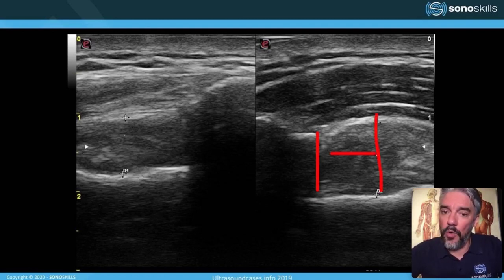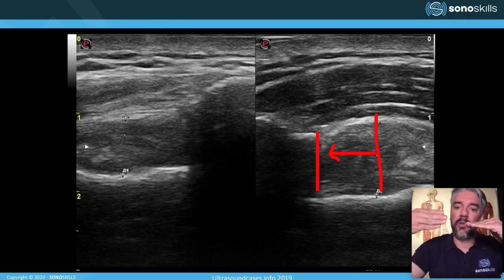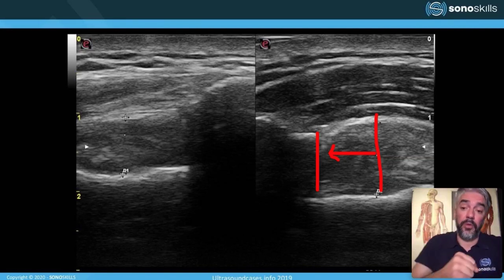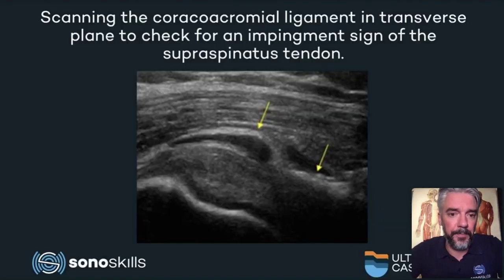So this won't fit into this inlet, the subacromial space, and friction is bound to happen. So you can see the tendon really hitting the acromion and then being pulled down with friction, and sometimes it's even impossible. So it blocks, and the patient cannot go any higher with his or her abduction.